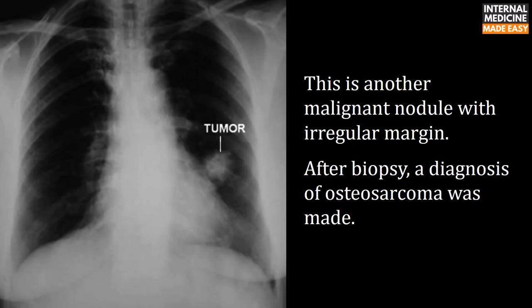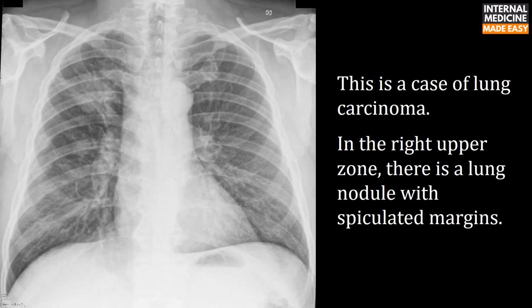This is another malignant nodule with an irregular margin; after biopsy a diagnosis of osteosarcoma was made. This is a case of lung carcinoma in the right upper zone showing a lung nodule with spiculated margins.